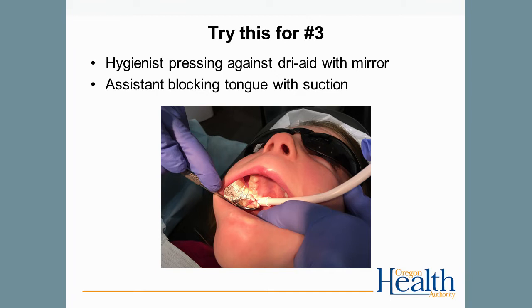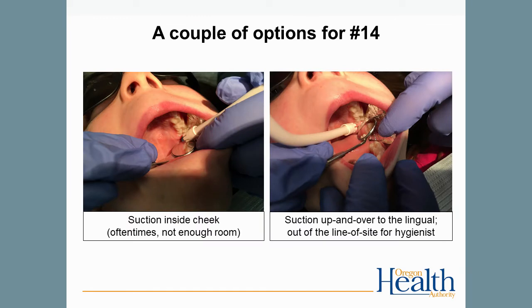This is one way to isolate tooth number three, with the hygienist holding the dry aid with a mirror and the assistant using the saliva ejector or HiVac to block the tongue. There's no need to press on the tongue — just ask the child not to touch the suction with her tongue. For tooth number 14, the most difficult tooth to seal, have the assistant hold the dry aid and the suction inside the cheek. Or have the assistant hold the suction up and over, coming in from the patient's right side, out of the hygienist's line of sight, but also blocking the tongue.